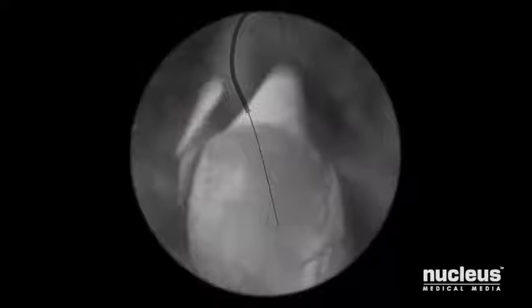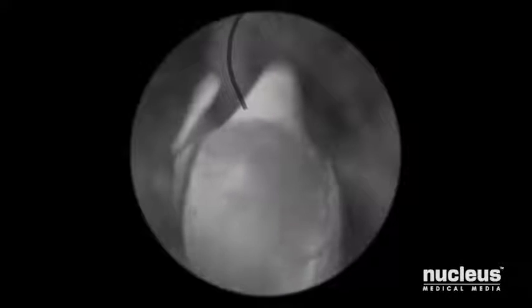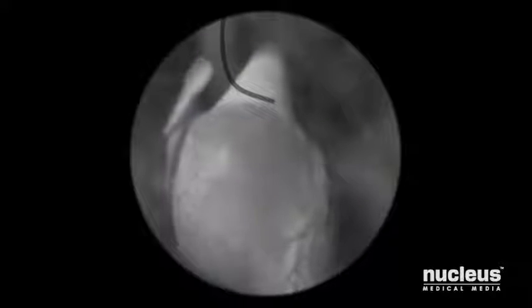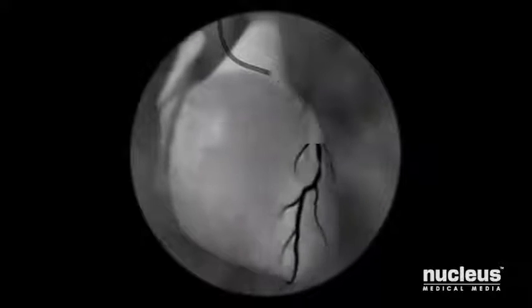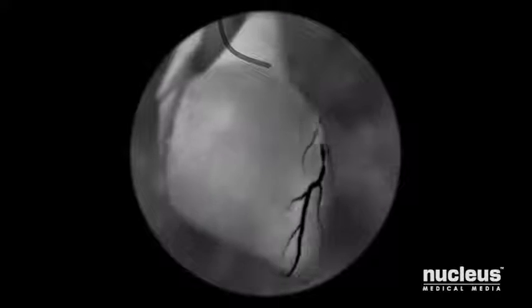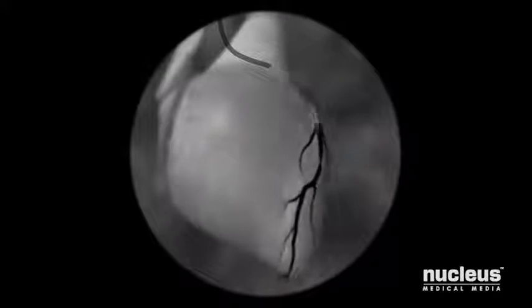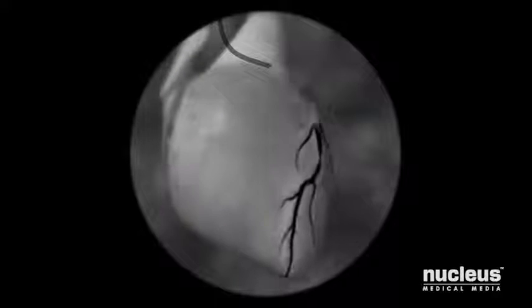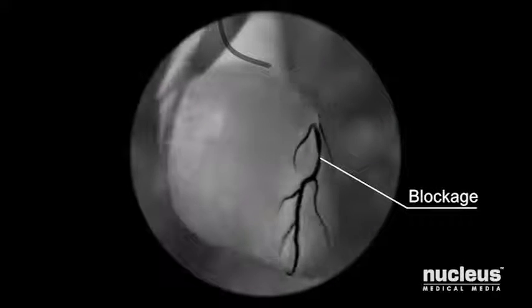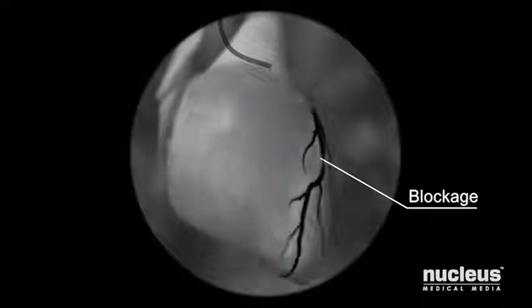At this point, your doctor will remove the guide wire, position the tip of the catheter just inside the coronary artery to be treated, and inject a special dye. The dye allows the fluoroscope to see inside your coronary arteries and take X-ray images called angiograms. Any blockages will be clearly identified as the arteries fill with the dye.